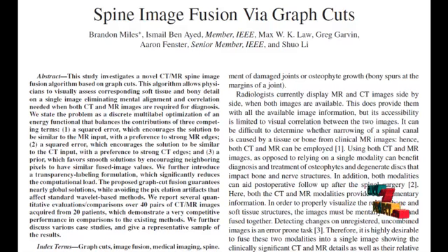FCM increases the accuracy of segmentation. We use both CT and MRI scan results of the same person. This fusion helps the physician to assess the soft tissue details. We perform the registration process initially, that is, resize the CT and MRI images to fuse the images. Fused details are used to get the bone details and other details from the given CT images. CT and MRI provide separate details. We get the bone details separately, and fused clustered images are retrieved from the segmentation process.